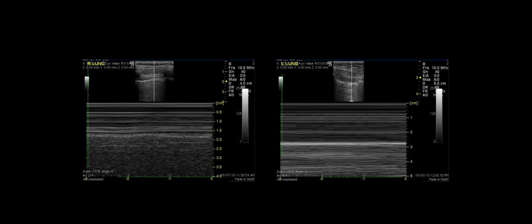lung, because of the relatively rapid movement of the lung up and down on these small irregularities, tiny imperfections in the surface of the pleura create this disruption to the sound wave at this level. And what happens is, instead of it being reflected uniformly as occurs in the soft tissues, it then gets a little bit scattered. And what it's been likened to is the sea in a sandy beach.